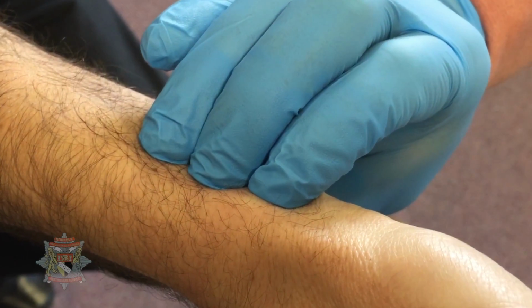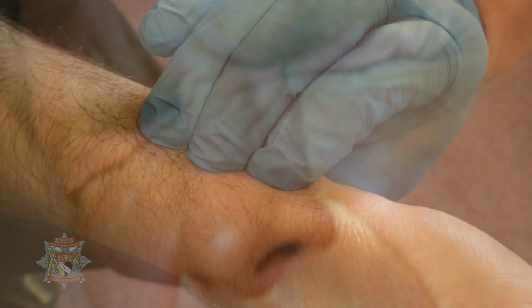Reassure the patient. The effective application of a tourniquet is inherently painful, and it is likely that the patient will be in considerable but unavoidable discomfort. Critical hemorrhaging can lead to imminent death. The correct and timely application of this simple device is an essential life-saving intervention. For further guidance, please contact a suitably qualified trauma care instructor.